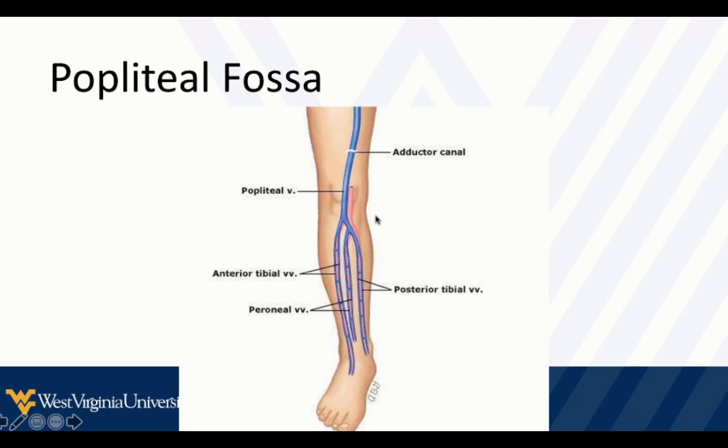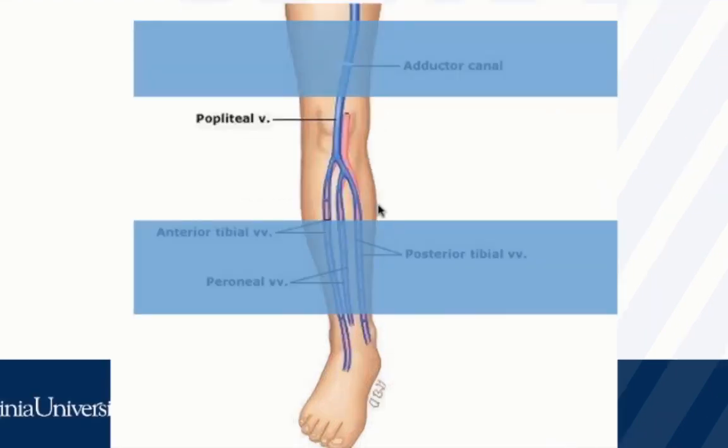After we've done that, we're going to move to the popliteal fossa. What we want to find is the popliteal vein, which again is going to be in contact with the artery. Once we find the popliteal vein, we will slide or fan the probe from head to feet until we see the trifurcation in the popliteal fossa. I don't think too much about the names of these veins — I just try to find all the branch points and make sure they all compress adequately.